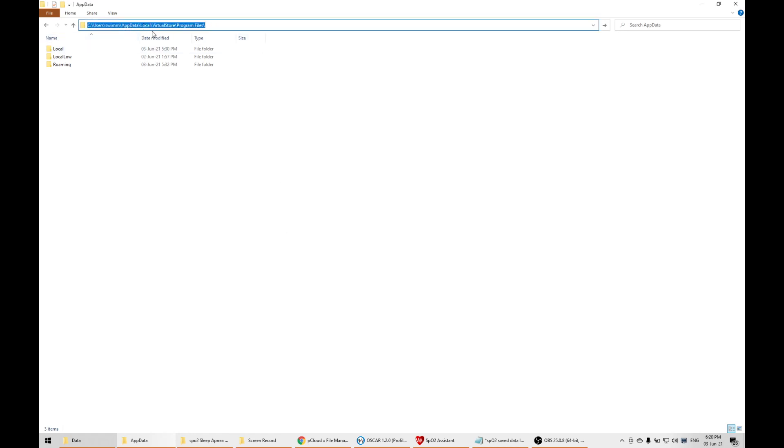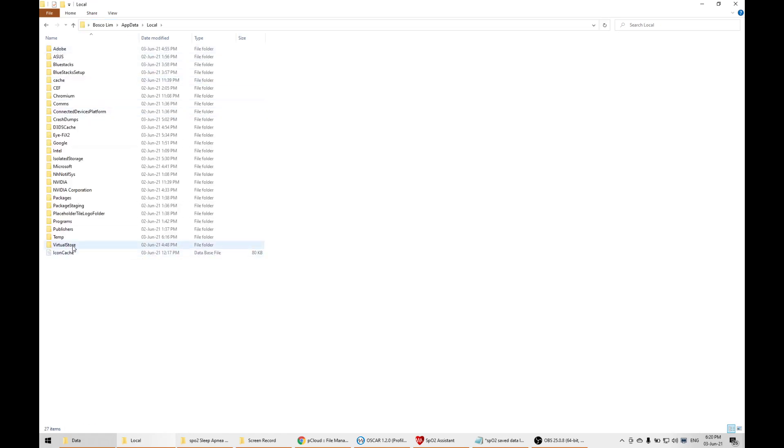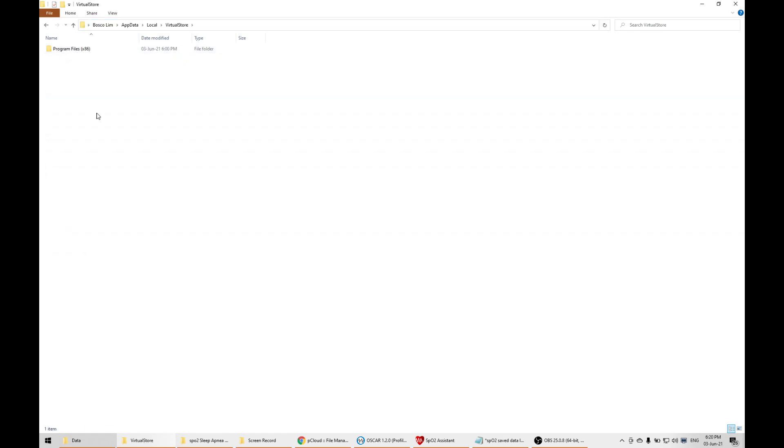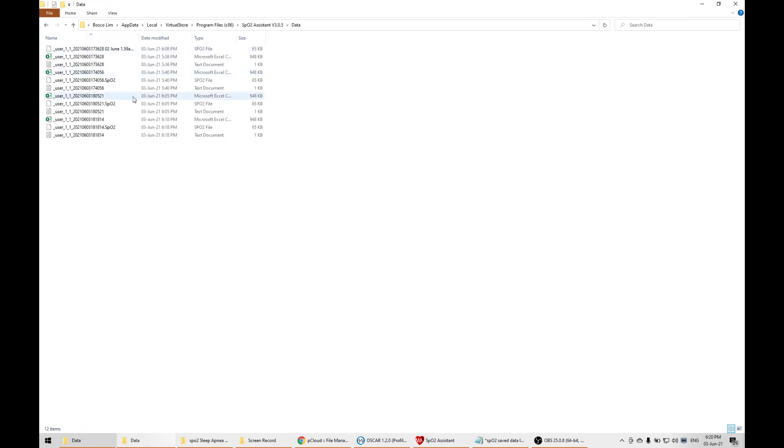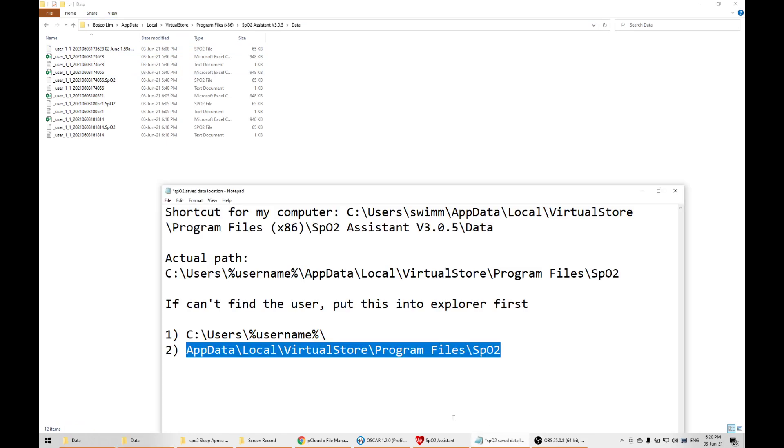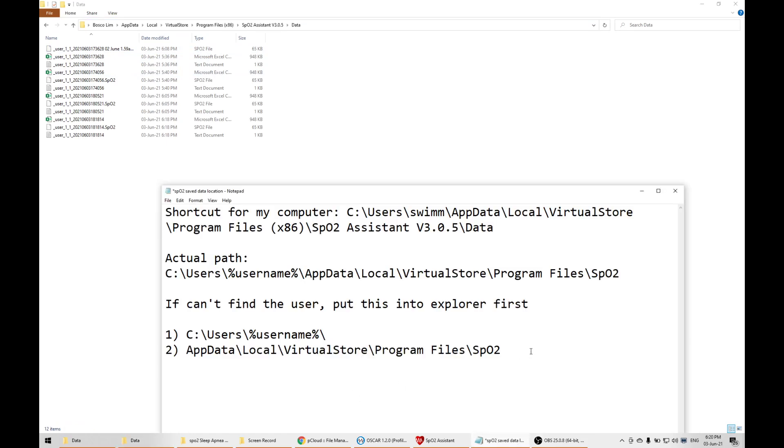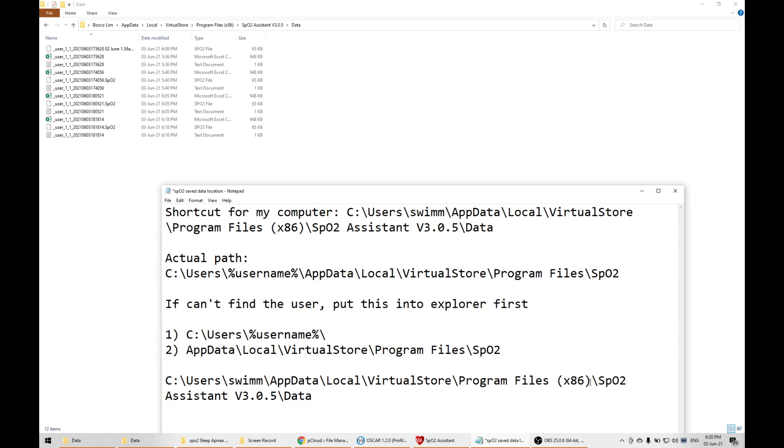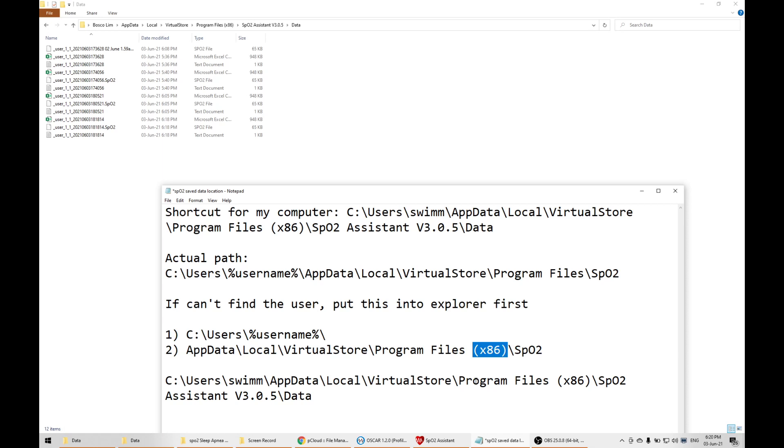I'm going to do it step by step: app data, local, virtual store, program files. I'm not sure why this link doesn't work. Let me do a comparison. Ah, there's a program files x86. It may differ from system to system. This means it runs in a 32-bit system. Older systems are 32-bit, newer ones are 64-bit, but this software is stuck at 32-bit.